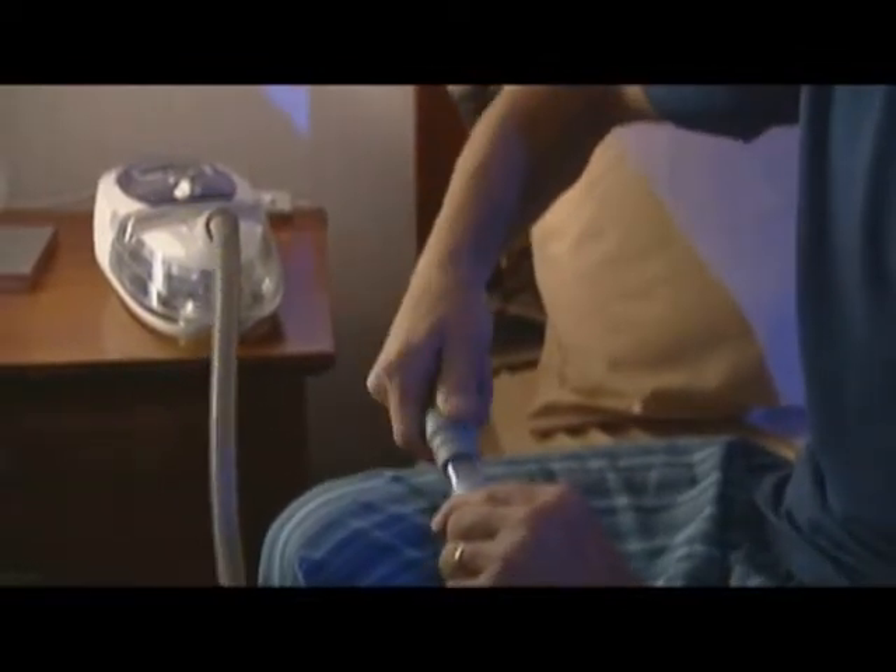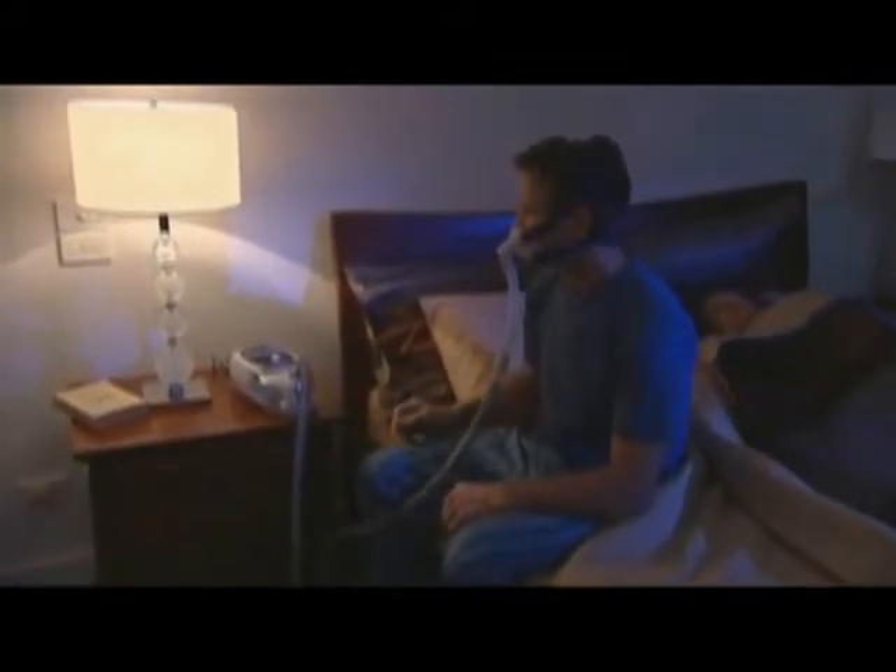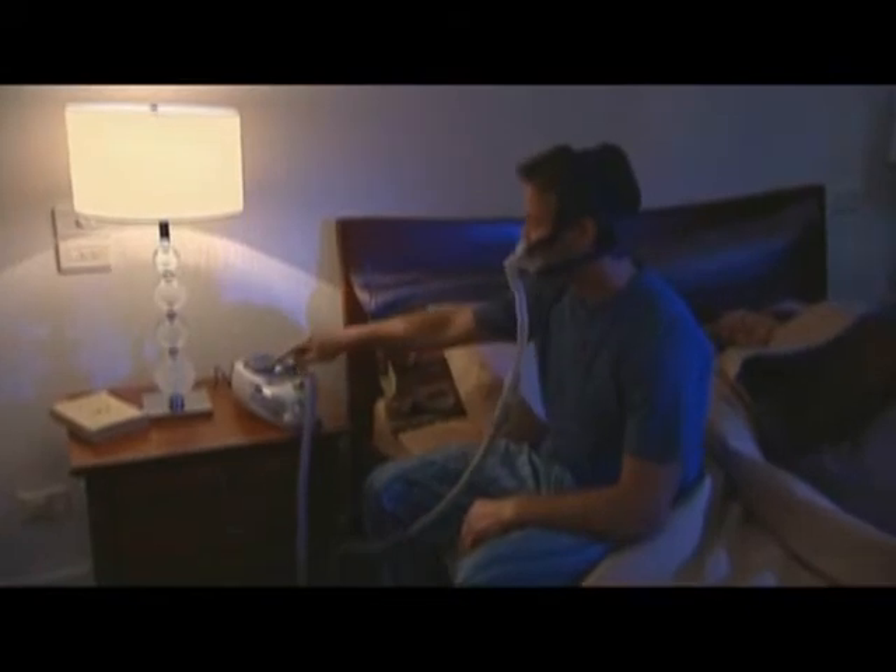You are now ready to connect your Mirage Liberty to your flow generator. First, connect the short tube assembly to the main air tube. Next, connect the elbow assembly to your mask by holding the sides of the elbow and firmly pushing it into the frame until it clicks into place. Once the elbow is connected, turn on your flow generator to check that you have a good seal.